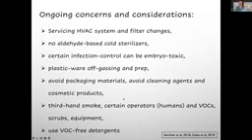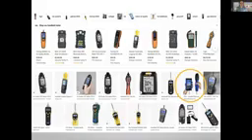Plasticware off-gassing and preparation was discussed. Avoid packaging materials in the laboratory, and avoid cleaning agents and cosmetic products. Cosmetic products often contain aldehydes. Avoid third-hand smoke. Consider VOCs from scrubs, humans, clothing, and equipment, and use VOC-free or nearly VOC-free detergents.